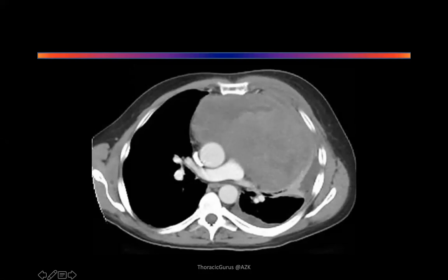Sir, the CT scan, chest contrast enhanced, at the level of bronchial bifurcation. At the level of pulmonary veins. Arch of aorta, pulmonary artery. So a large left pleural and mediastinal mass, homogeneous, well margined, no irregularities. Is it homogeneous or is there some change within it? Little bit of hemorrhagicity. Actually, it's multilobulated, don't you think so? There are multiple lobules within there. If you stand back and look, you will see there's a different density here. There's a different density here. So it's more like multilobulated. The word I would use is multilobulated. Okay? You can see there seems to be a capsule. Agree? Yes, a thick wall is there.